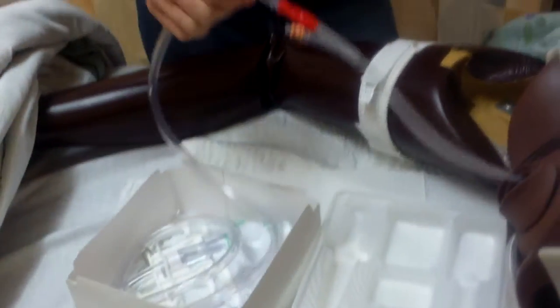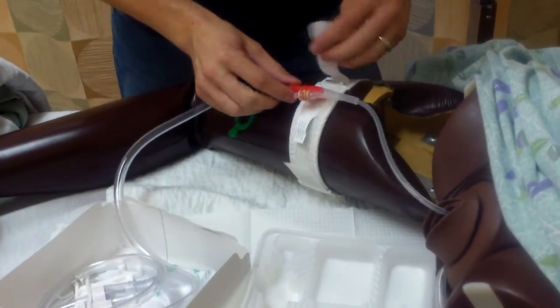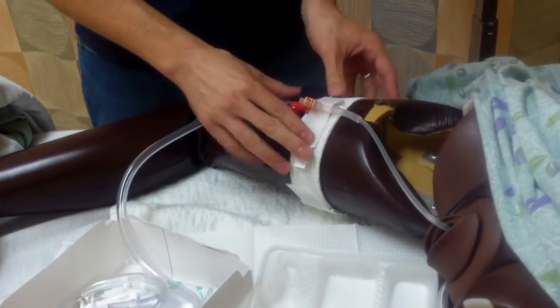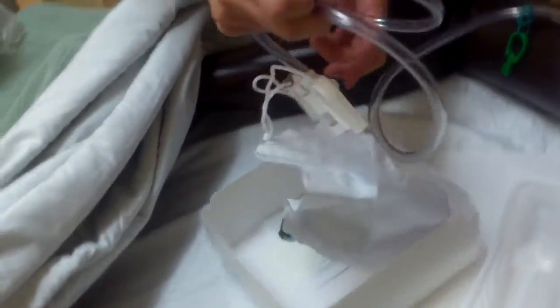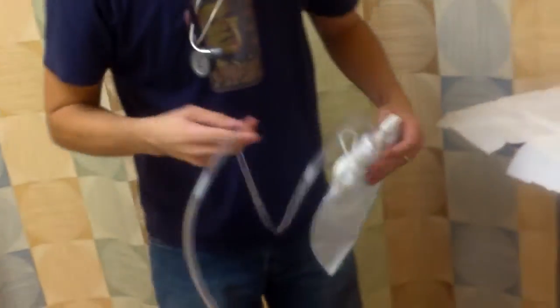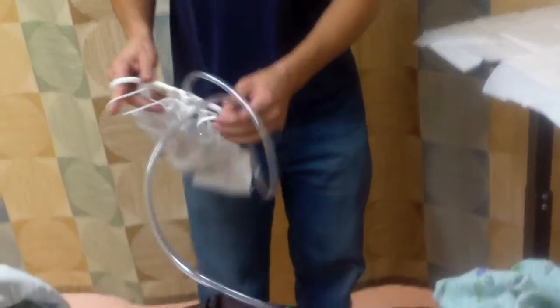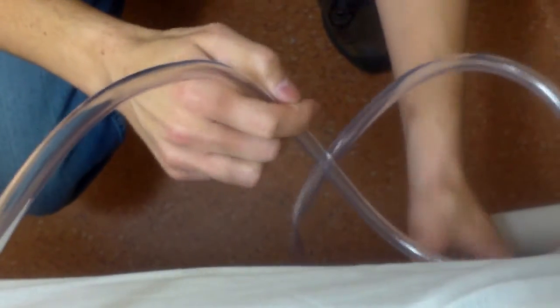And then I'm going to take my Foley catheter. Make sure there's a little bit of slack here so that it's not tugging, causing my patient any pain. Okay. Make sure that's there. So that's good. There's some slack right there. Okay. And then I'm going to attach the bag over the leg. That would be these little wings out. Okay, make sure there's no kinks. And then I'm going to attach it to the side of the bed here. Okay. And it's unclamped and it's ready to go. All right. There we go.